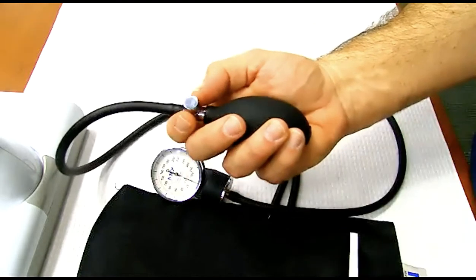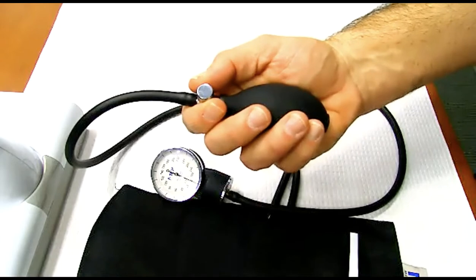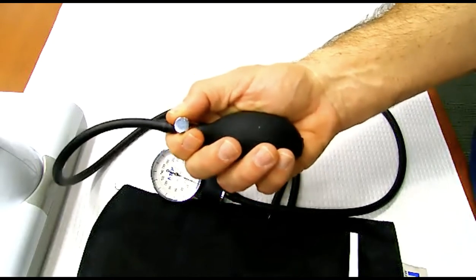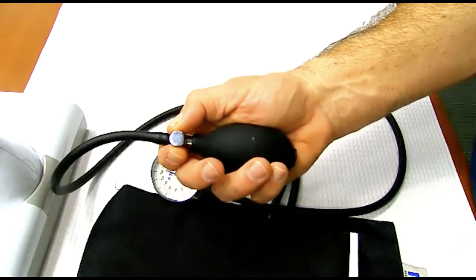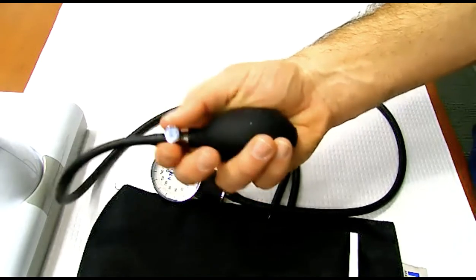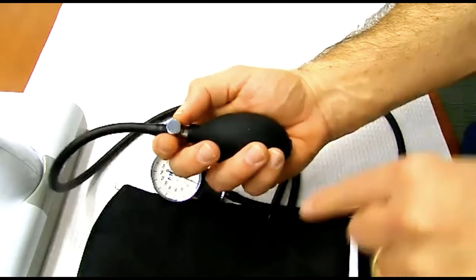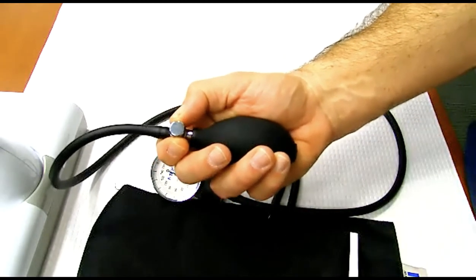If you turn it counterclockwise, then it will start to let the air out. The problem here is that there's kind of a sweet spot. When you practice this, you'll notice you'll be turning, nothing, and then it all leaves at once. It takes some fine motor skills to barely turn it right at the sweet spot to be able to control the rate of deflation. So remember, all the way to the right, or clockwise, will lock it so that the air doesn't come out. To release the air, you rotate it counterclockwise to the left until it deflates at the rate that you want, okay?